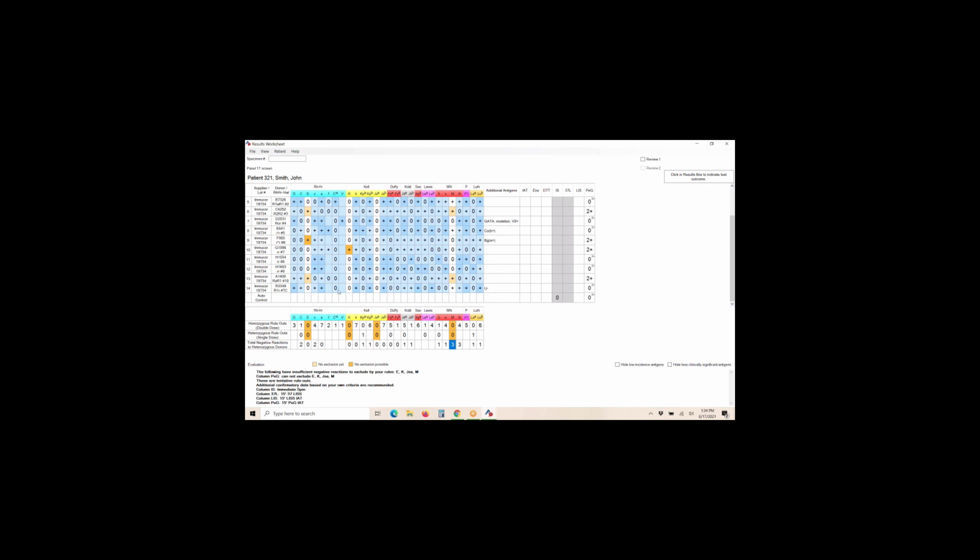And in this example, we don't have one, but you could even have where you have an E and a K positive cell. They would both be the light orange, because you can't say, well, is that reaction because of the E or the K? Well, it's because of both, but you don't get to count it if it's not by itself. It's not isolated. Okay.